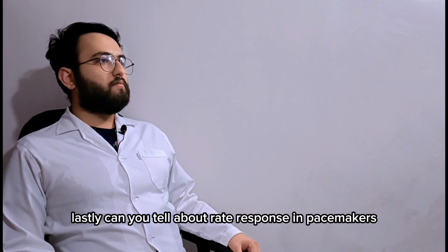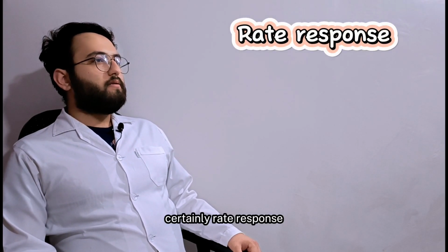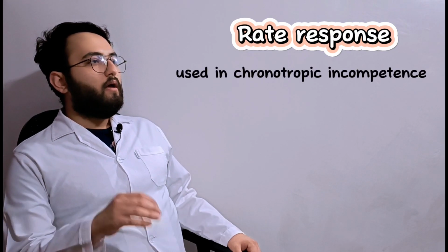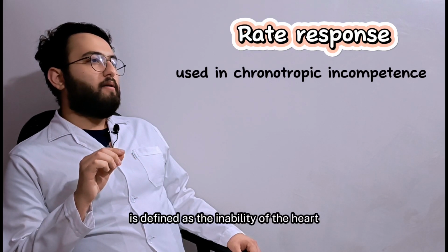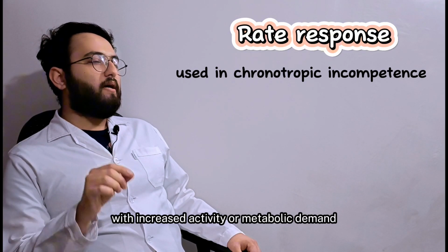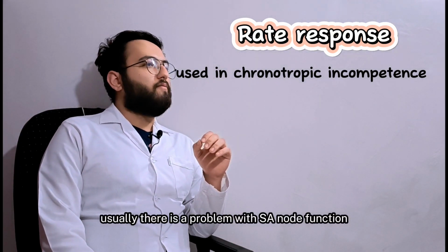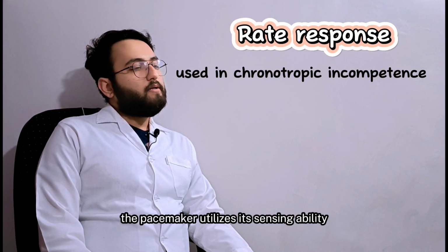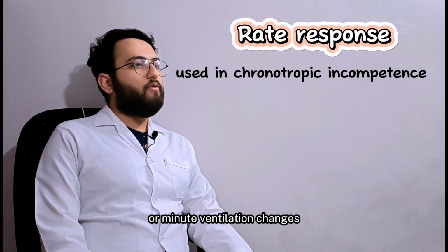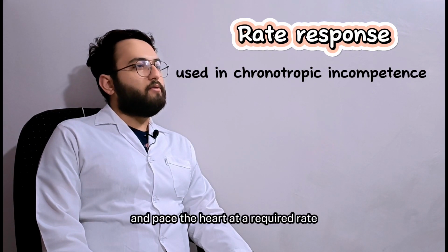Fascinating. Lastly, can you tell about rate response in pacemakers? Certainly, rate response or rate adaptive pacing is used in patients with chronotropic incompetence. Chronotropic incompetence is defined as the inability of the heart to appropriately increase its rate with increased activity or metabolic demand that leads to exercise intolerance. Usually there is a problem with SA node function. The pacemaker utilizes its sensing ability with the aid of sensors that can sense motion or minute ventilation changes according to the activity and pace the heart at a required rate.